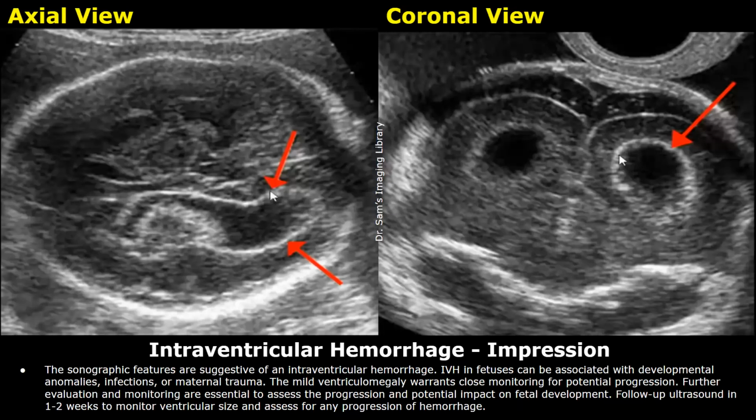Further evaluation and monitoring are essential to assess the progression and potential impact on fetal development. Follow-up ultrasound in 1 to 2 weeks to monitor ventricular size and assess for any progression of hemorrhage.